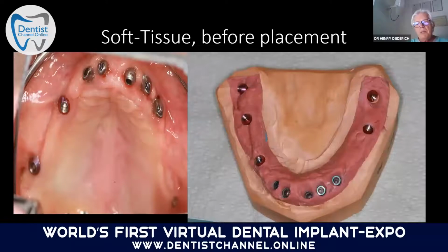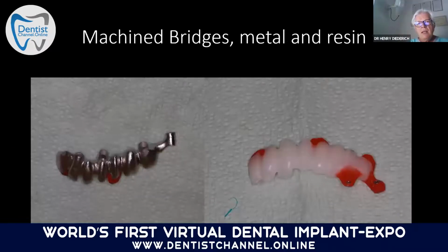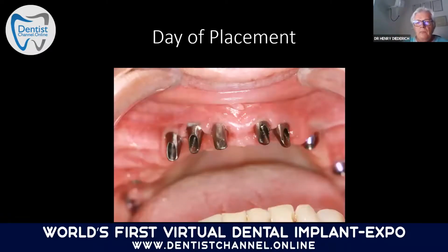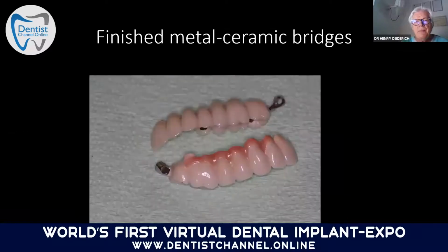That was before placement. You see the model on your right. You see the mouth soft tissue before placement. And then you have here the bridges, machined bridges. That was a metal resin try-in another time. And here was work in progress. You see here our pterygoid implants, our two-piece implants, classical implants, and then where there was no bone, we could put our plates. And that was the day of placement.